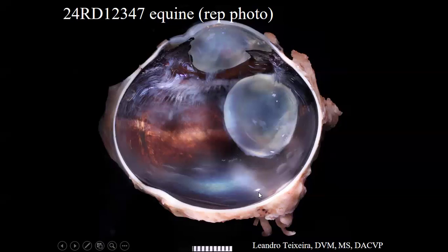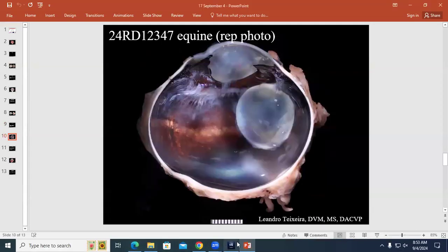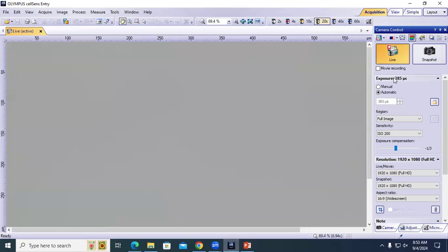Well, I was going to say that's optic nerve, but it could be just the light passing through the lens and being focused on a very weird location. I think the optic nerve is probably right there, right? So mainly a gross image for the ciliary body surface. Now let's get back to histology.